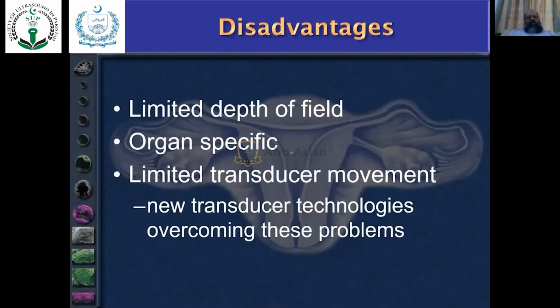Limited transducer movements, but new transducer techniques are overcoming these problems because their head houses crystals and the head can even move in some limited angles.